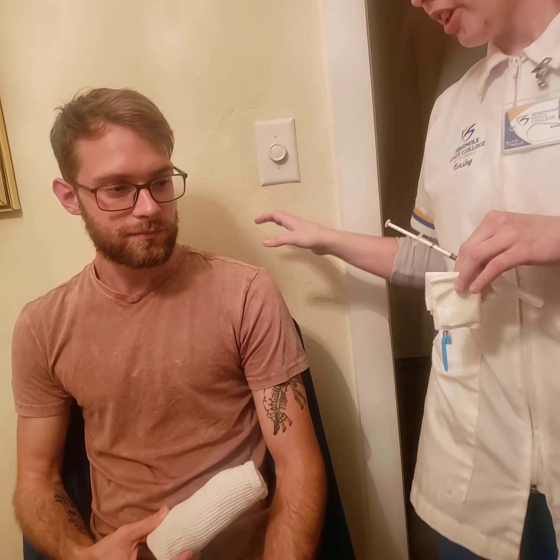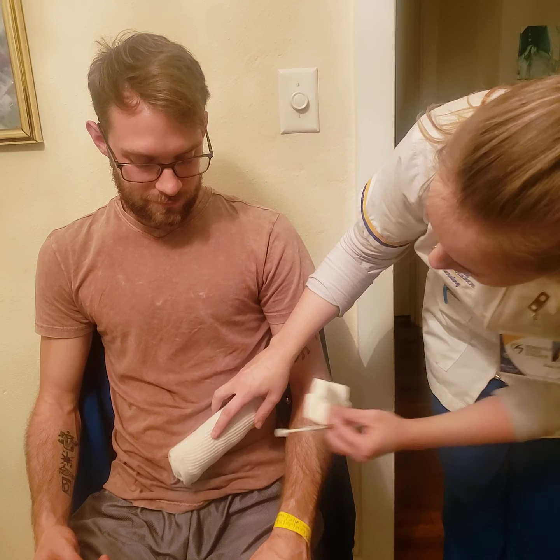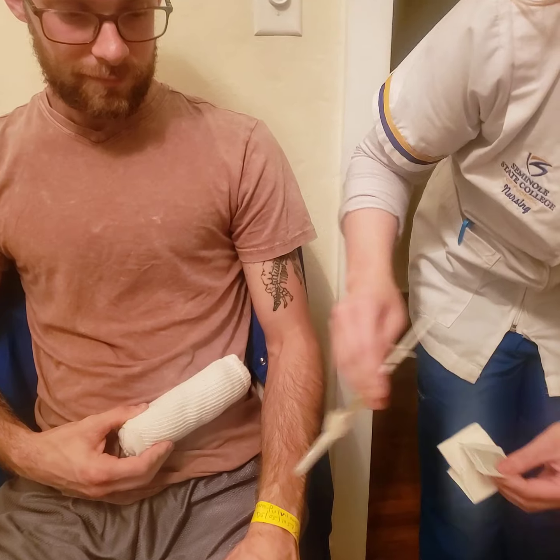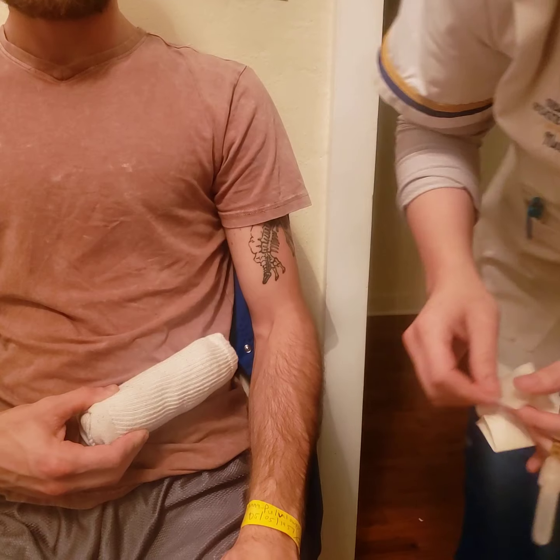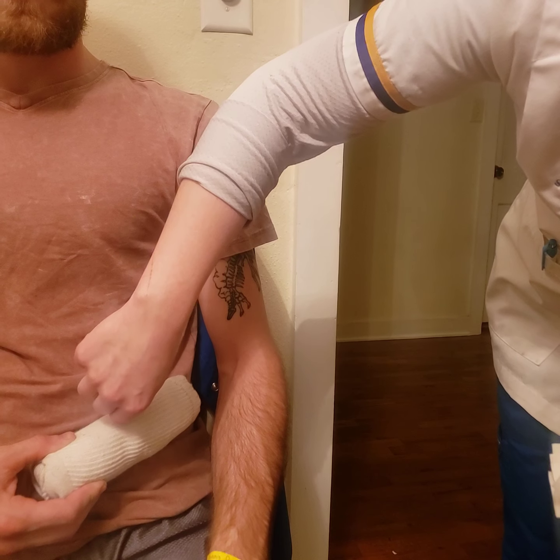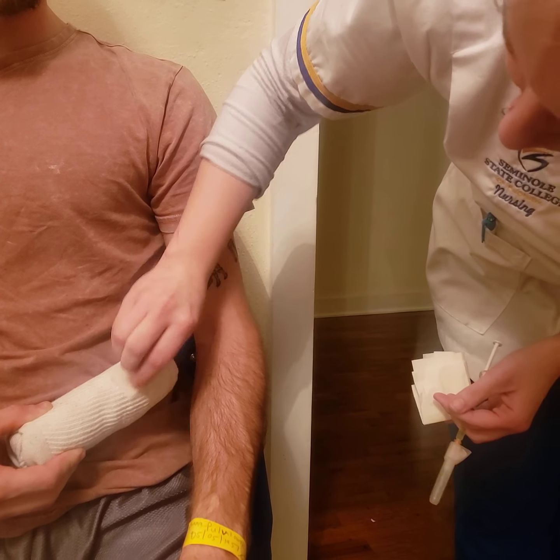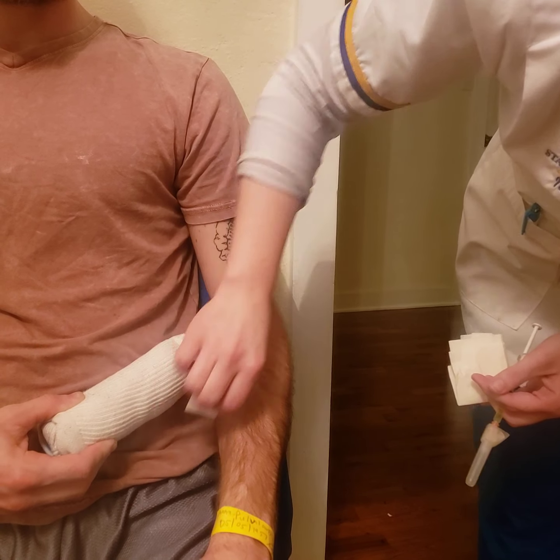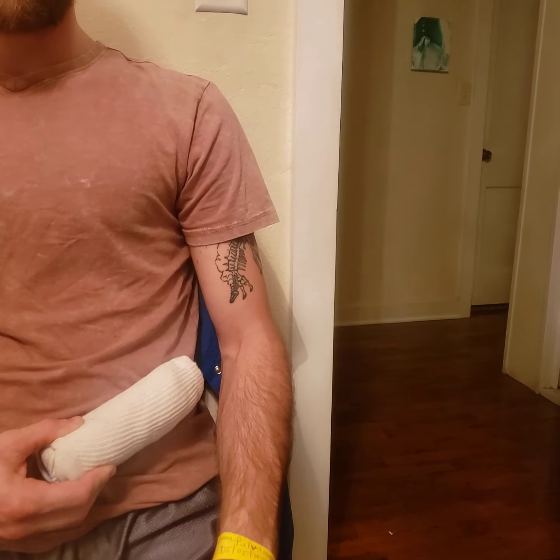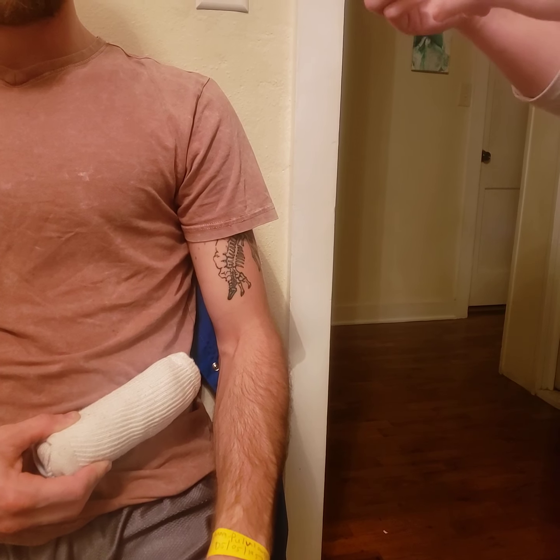Okay, Miss Anna. So I'm gonna position your back in your bed a little bit just so that you can relax and not be sitting up. Bend your knees, okay? So for this one, this is gonna be a subcutaneous injection. And I'm gonna start again by cleaning my injection site, starting in the middle and going outwards. So if his umbilicus is here, I'm gonna go at least 2 inches away. So I'll be going about right here. Starting in the middle and then moving out, away. And we're gonna let that dry. Alright, that's nice and dry.